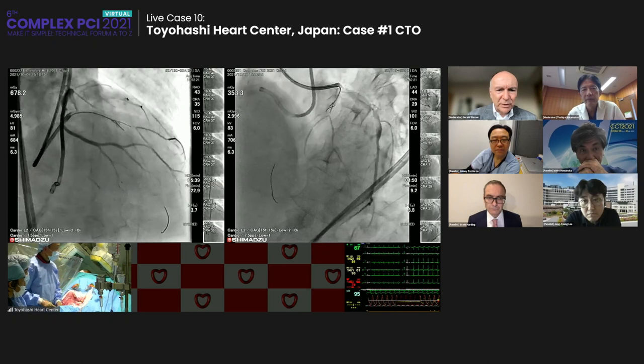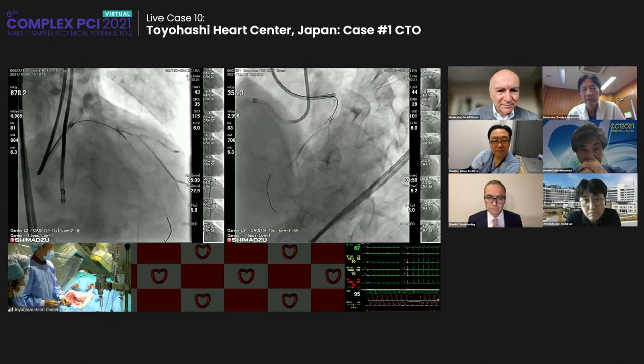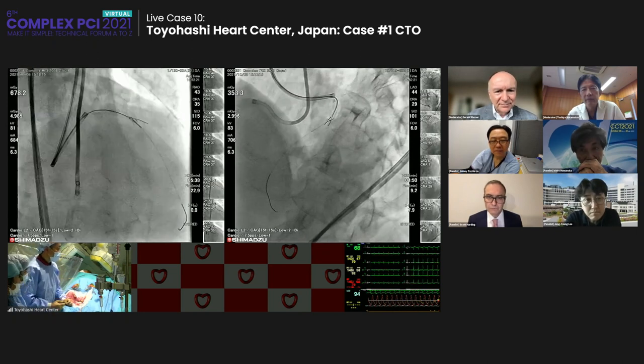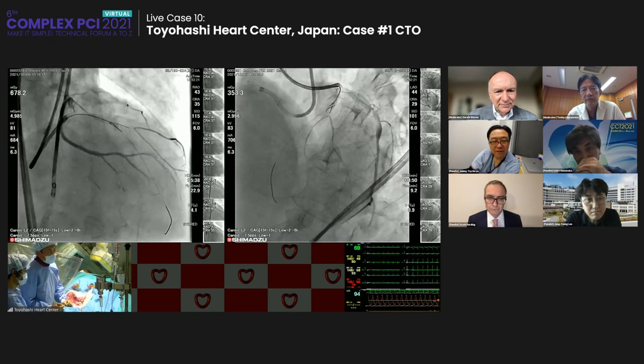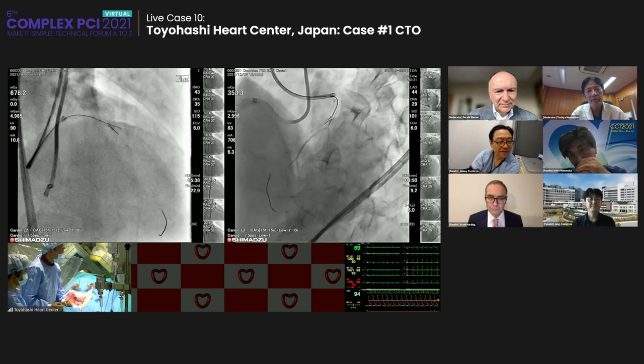What's the tip of the wire doing, Kenya? It's a little bit different. A little bit deflected to the left, isn't it? A little bit down there.